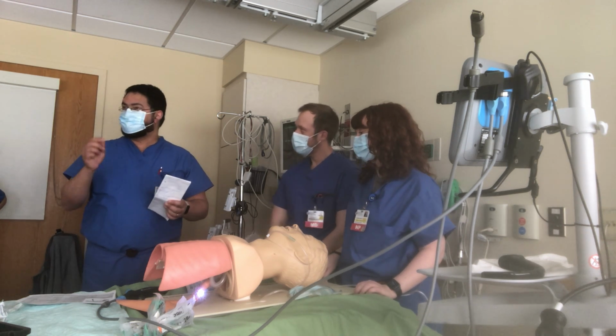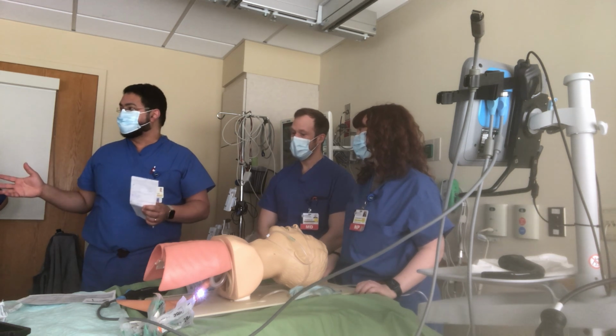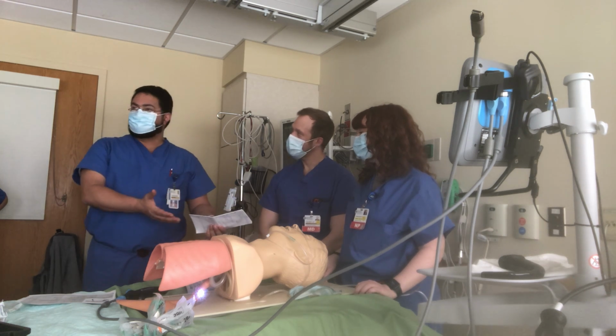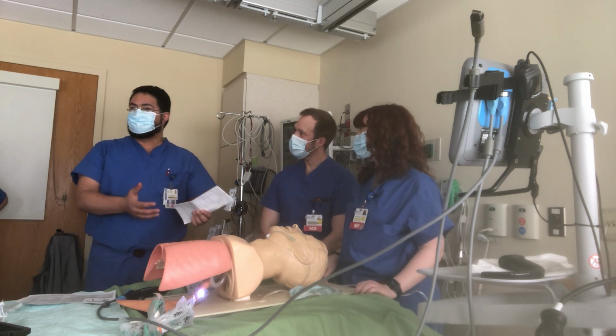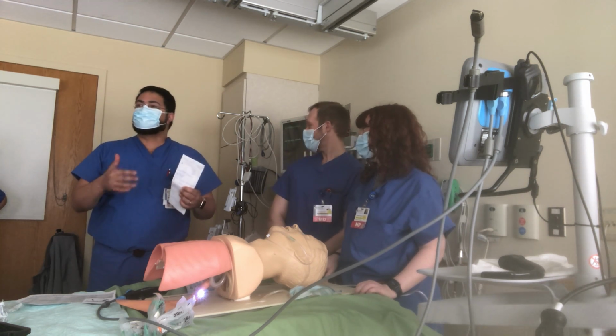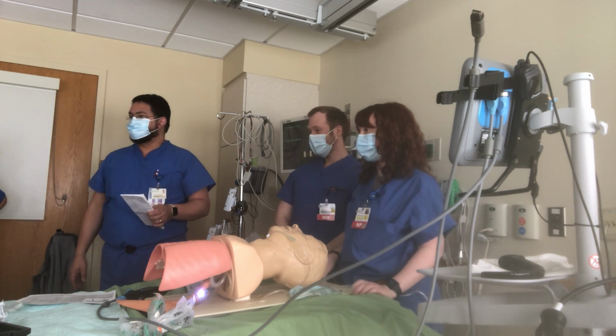So awake fiber optic intubation is a safe procedure. You're probably not gonna lose anybody doing it. It's gonna take time, and it's supposed to take time. If you actually cut corners, you are not gonna be able to, and you're gonna spend so much time in the airway. So how are we gonna numb the airway?